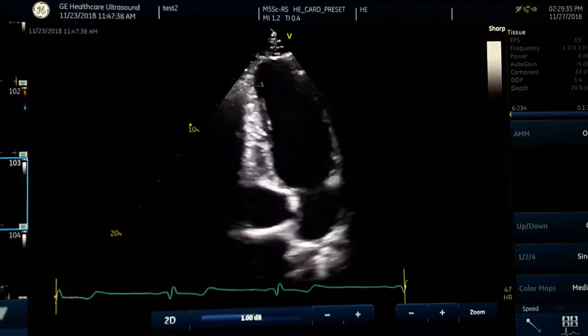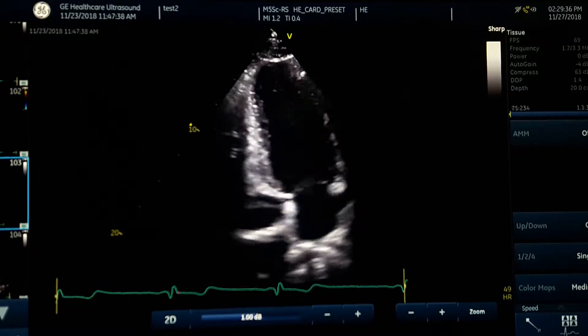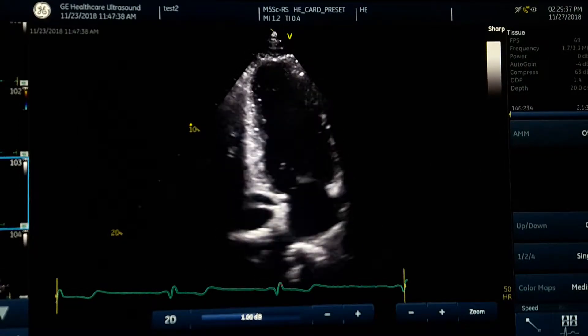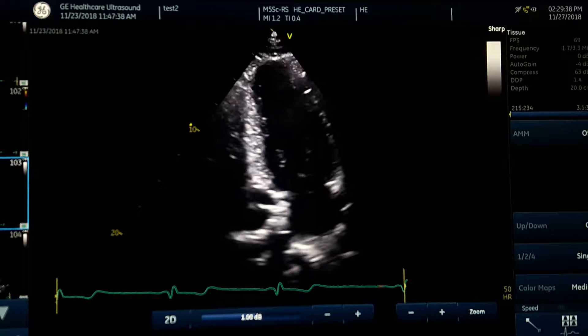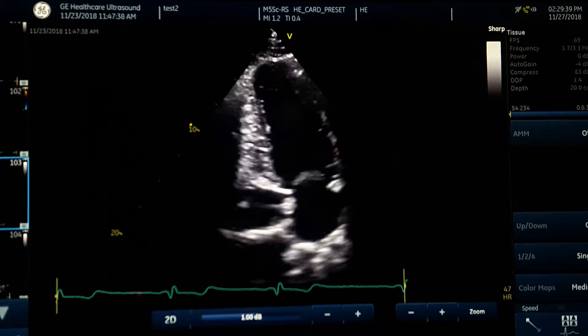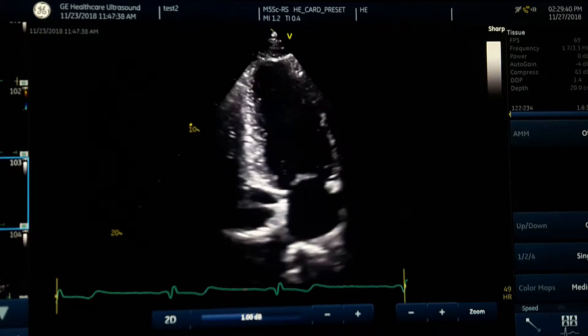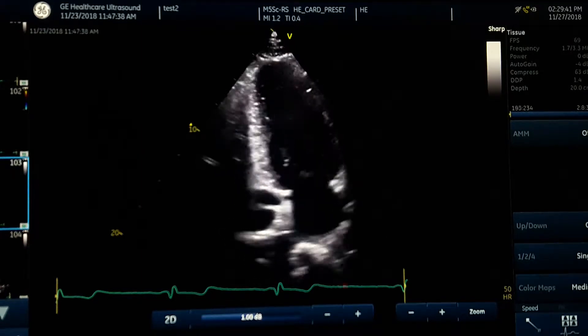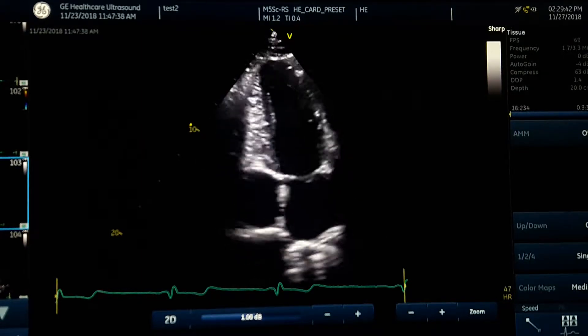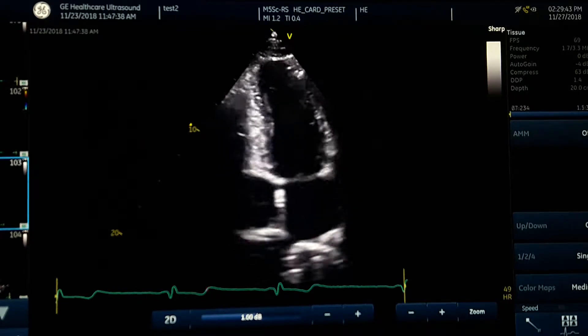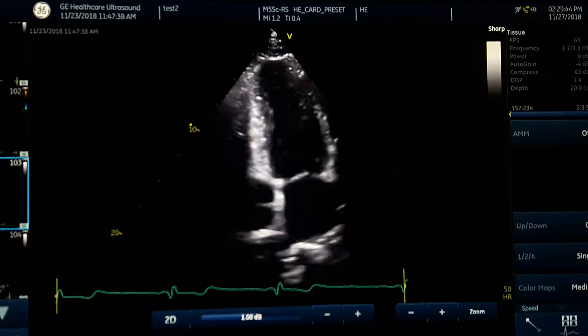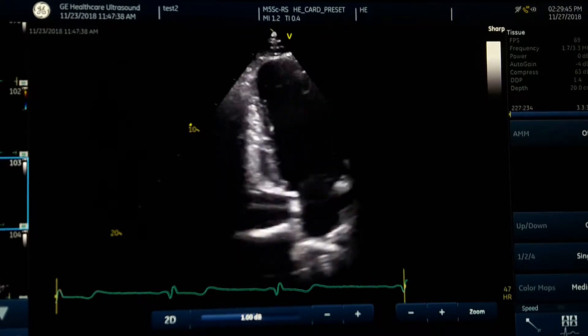Apical 2 chamber view. Getting the Apical 2 chamber is very easy — you just have to have a good Apical 4 chamber view.